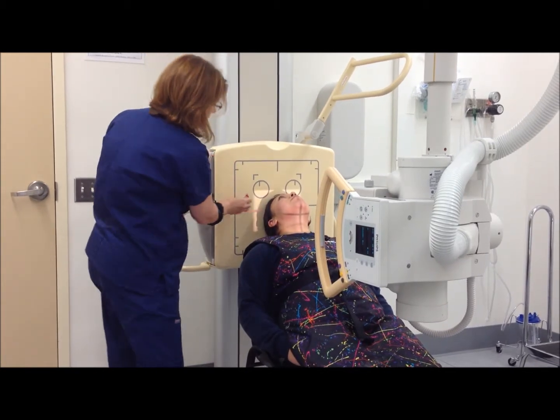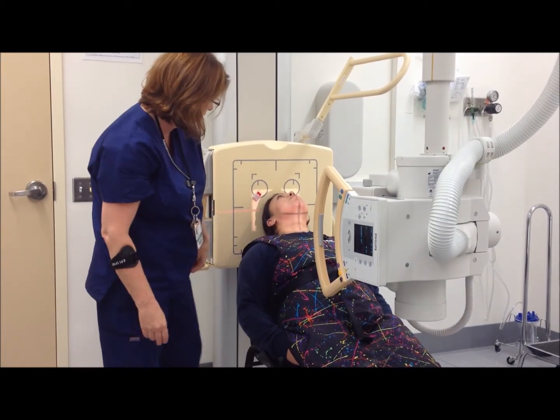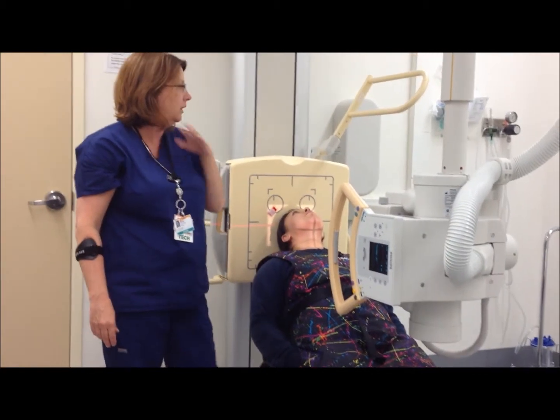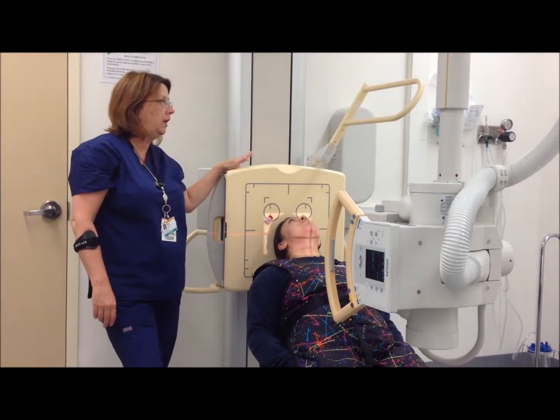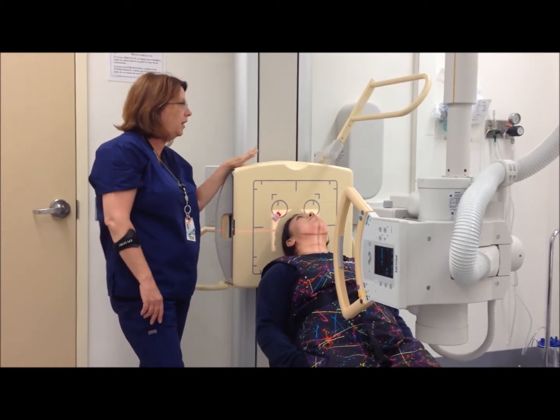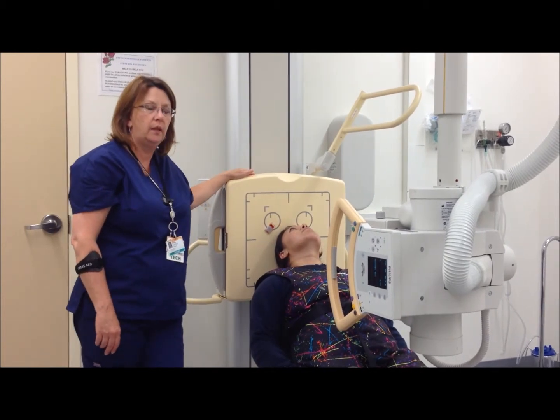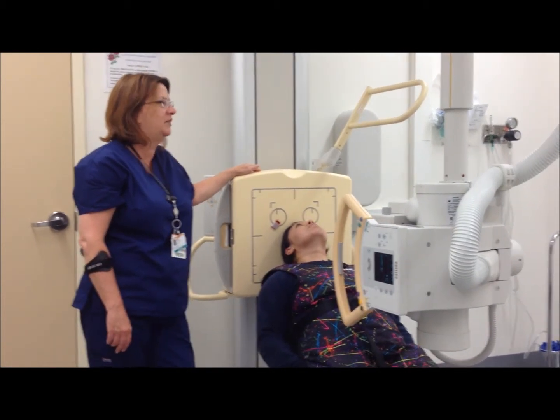My right marker will go in the light field next to the patient's shadow. This will show the body of the mandible, the coronoid, and the condyloid processes of the rami. My technique will be 70 to 75 kVp at 12 to 15 mAs.